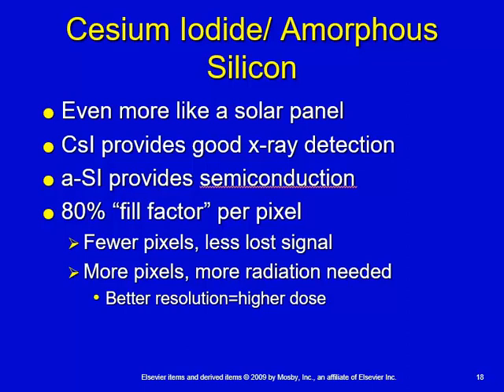They could have made them smaller and thereby increased spatial resolution, but by increasing spatial resolution, the area that was sensitive to and capable of creating the signal would go down. So your fill factor will go from 80% down to 60% to 40%, depending on the size of your overall pixel. So patient dose would go through the roof.